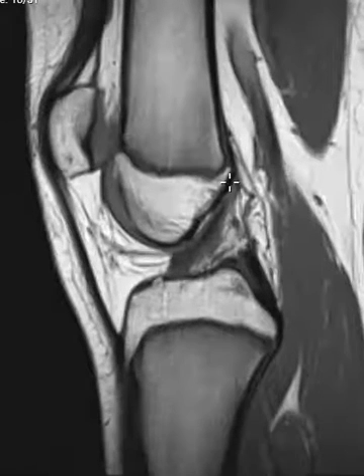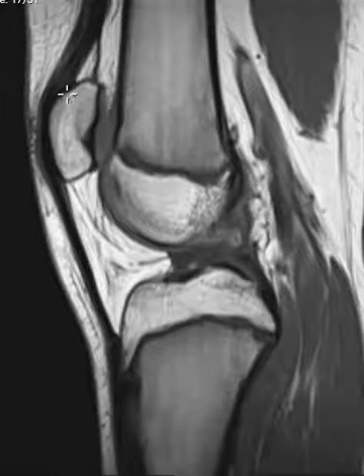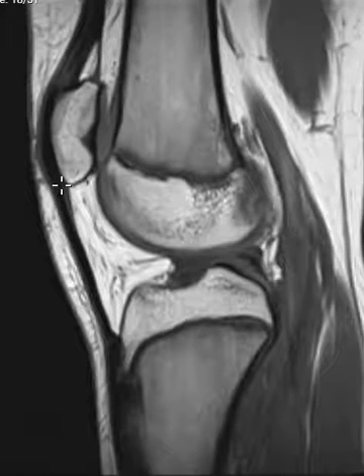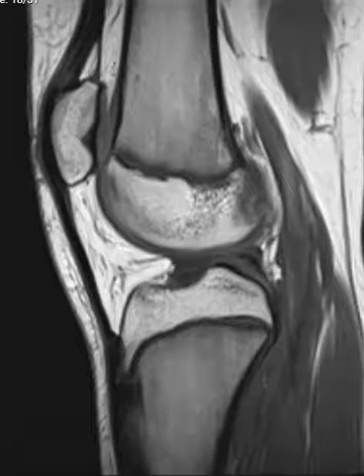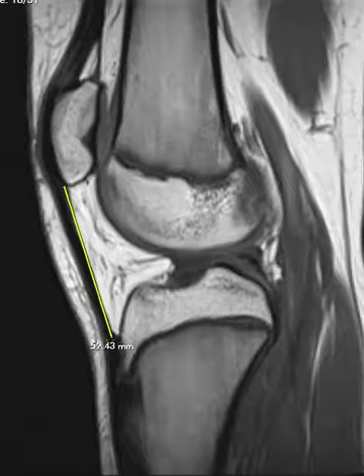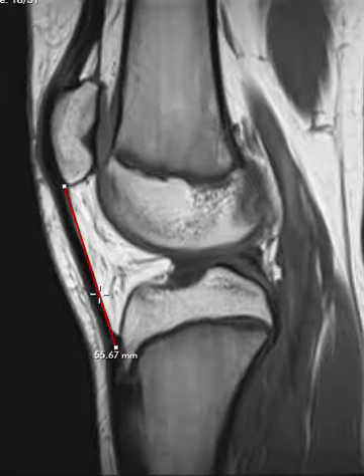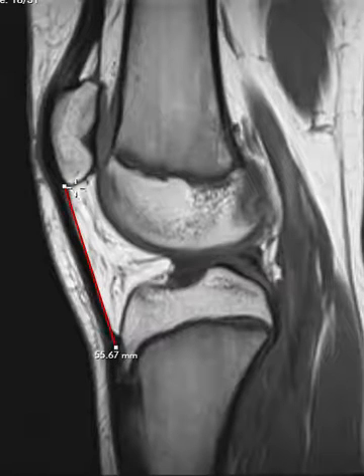This patient had a normal exam except for one thing. In the front of the knee, we see the patella or kneecap right here, and we see this patellar tendon that comes off the bottom. This is a little bit too long — it's called the patellar tendon, and normally it measures about 4 to 4.5 centimeters. This one is 5.5 centimeters — a little bit long.